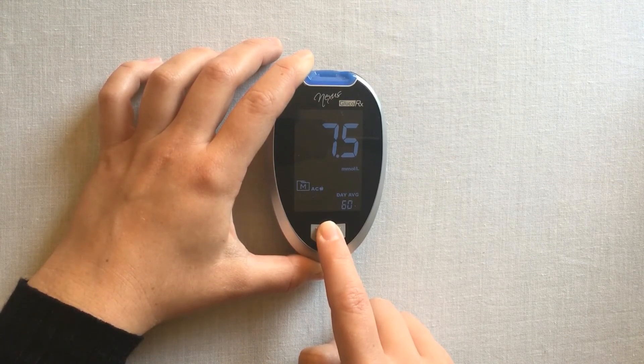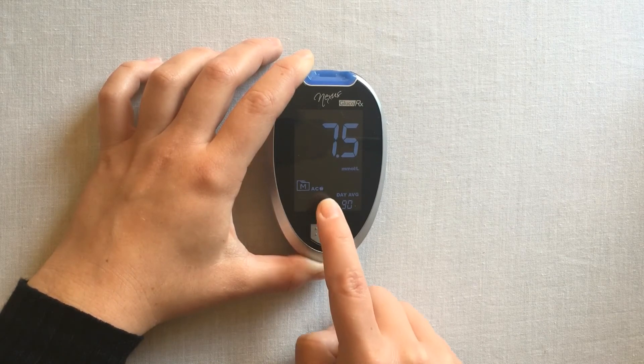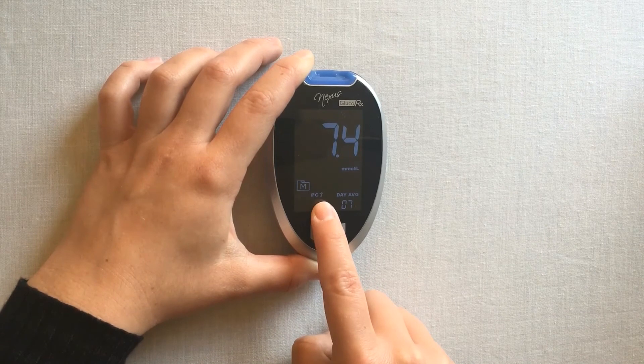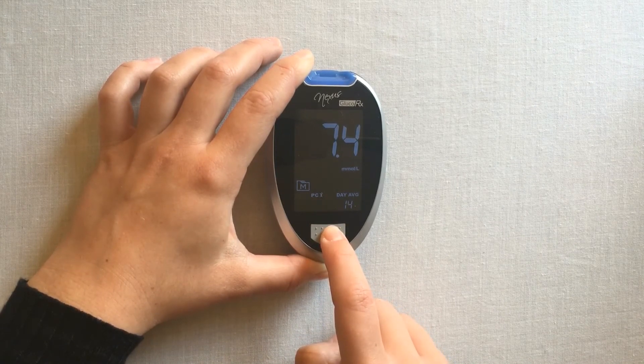Notice that you will first be shown averages for general, followed by AC before meal and PC post meal. Your meter will automatically turn off once you've advanced through all of your averages.